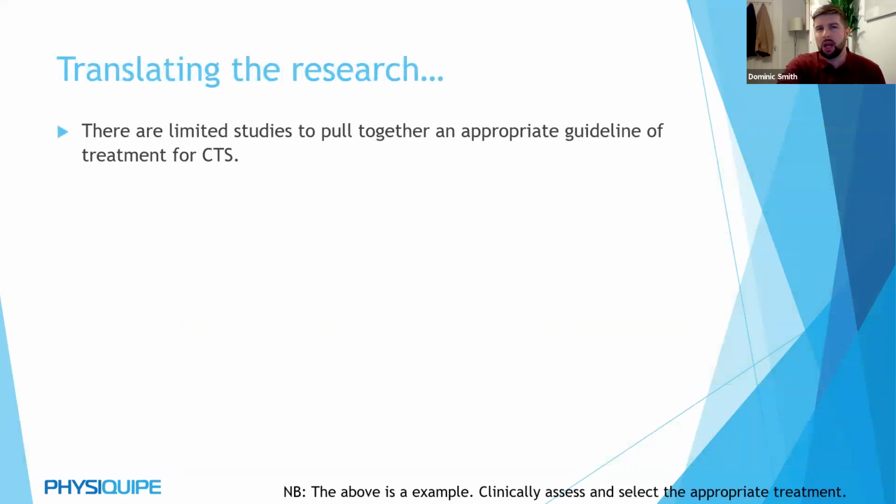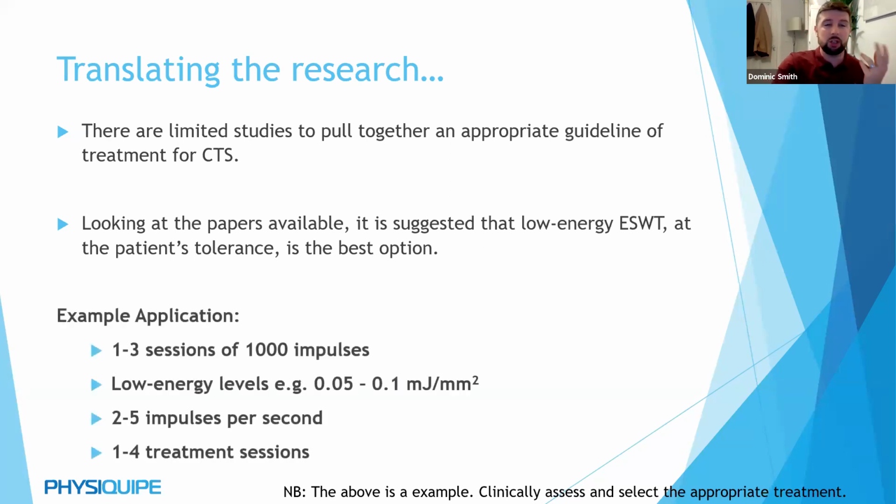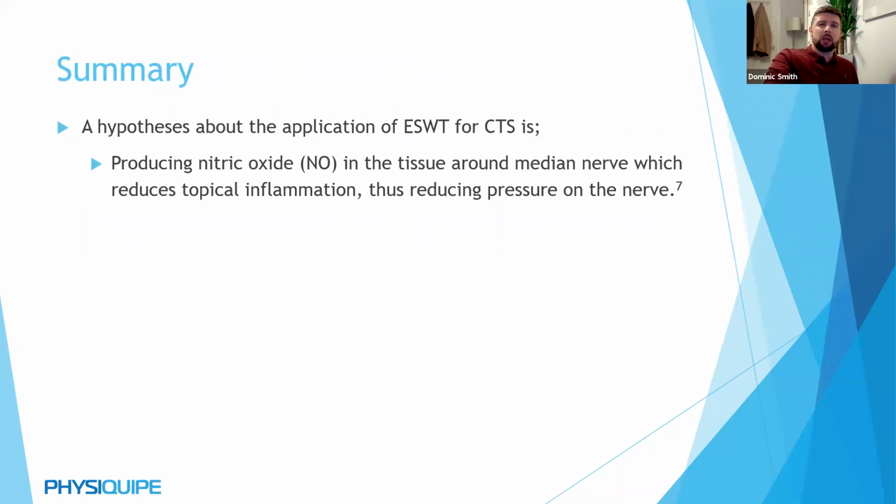So if we're translating the research, there are limited studies to pull together for the treatment of this. But looking at the papers that we've got available, it does suggest that lower energies and around patient tolerance is probably the best option for you rather than hitting them too hard, because we know with carpal tunnel, it can be quite sensitive. So an example application, 1 to 3 sessions of 1,000 impulses, and then low energy levels, so 0.05 to 0.1, 2 to 5 impulses.